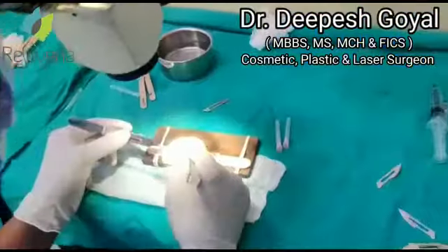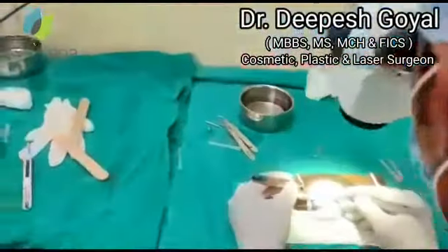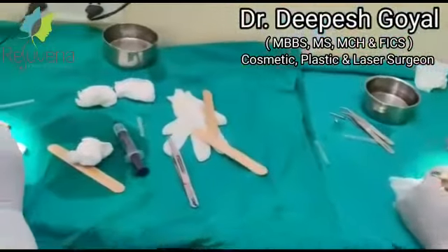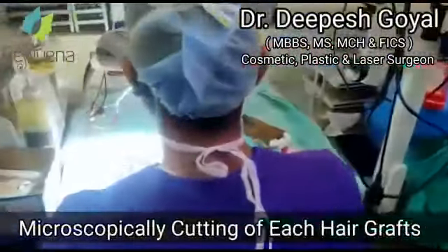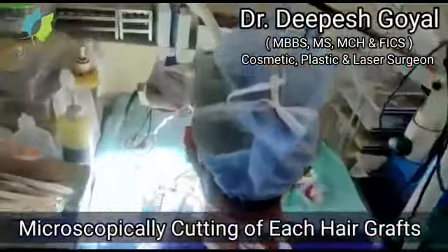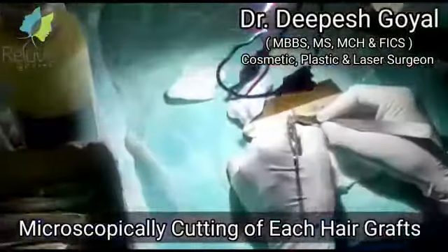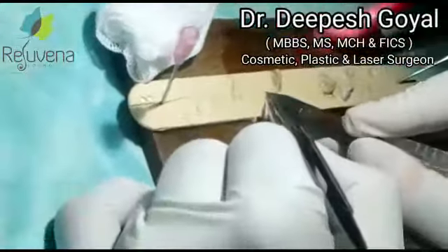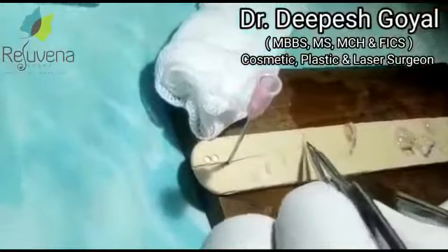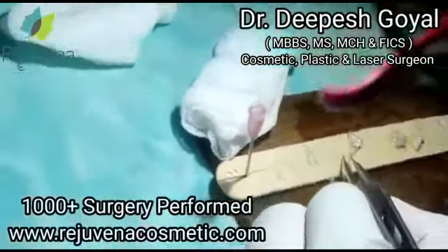After taking this strip, our team separates each hair graft one by one with the help of our German microscope. Single, double, triple, and four-hair grafts are separated individually.